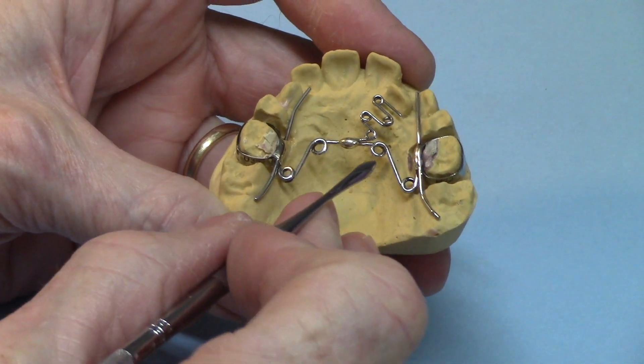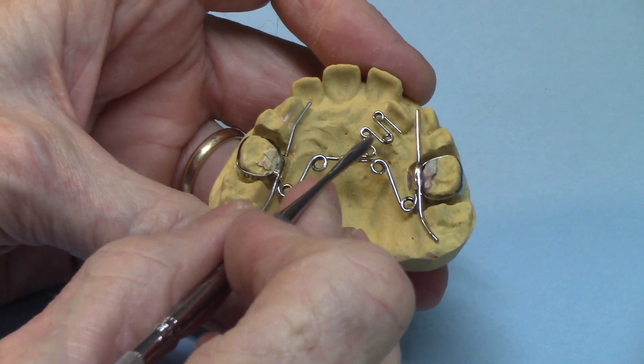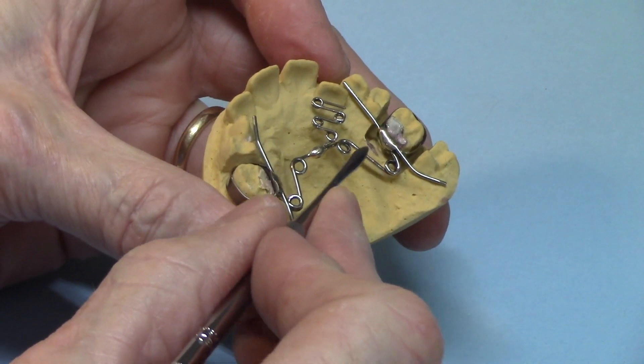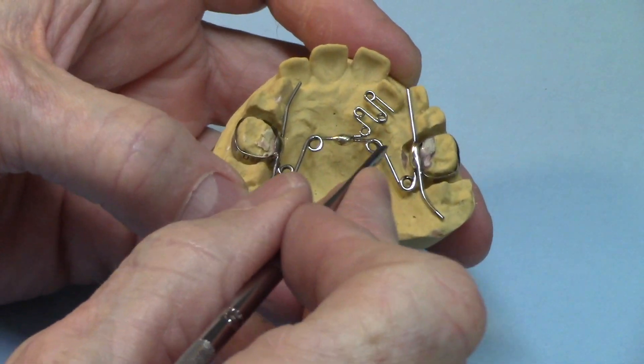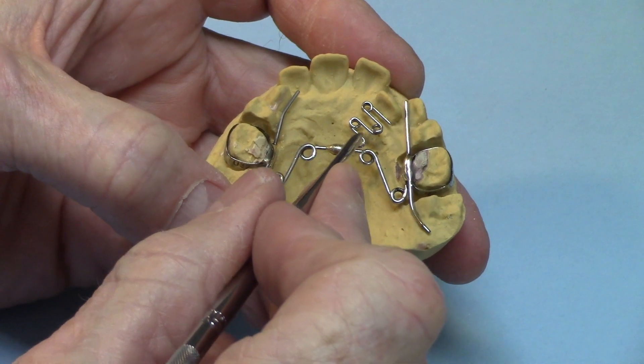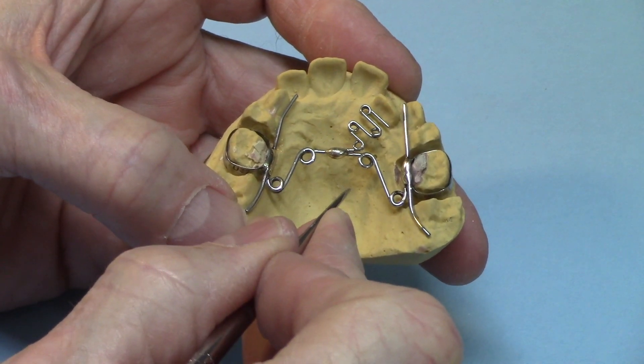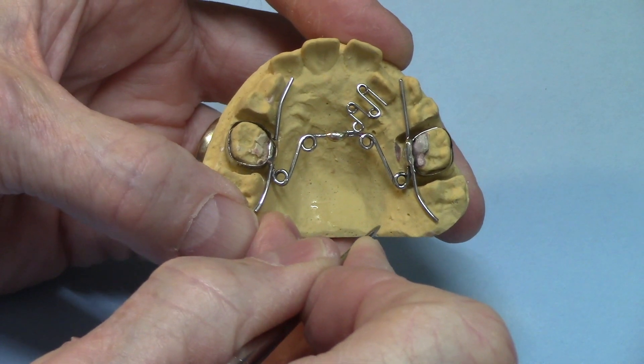Here's this pretty wild looking quad helix appliance with the soldered spring. It's really hard to get in here and solder these areas without overheating the surrounding parent metals, and especially this .025 spring right here without annealing this area. So let me show you how to do that.